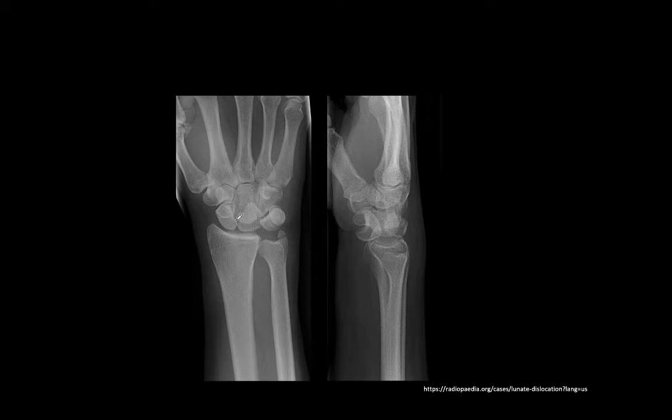Now remember, there's two carpal rows, proximal row, distal row. The arcs of carpal alignment are the arcs of Gilula, actually, they're named after someone named Gilula. The first arc is drawn along the proximal aspect of the proximal carpal cortices. You'll notice the scaphoid and the lunate line up fairly well proximally, but the triquetrum's a little inferiorly or proximally malpositioned.